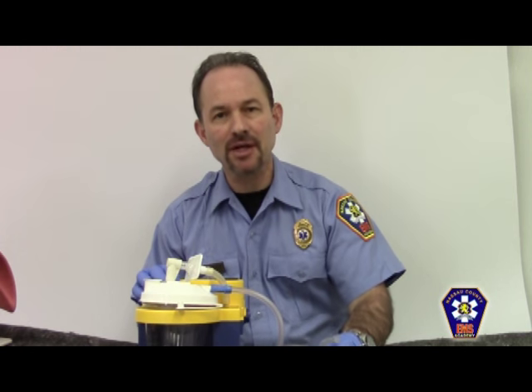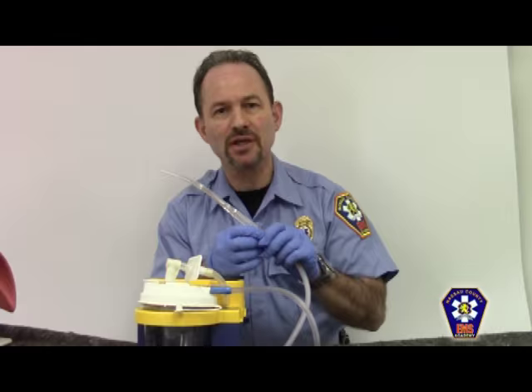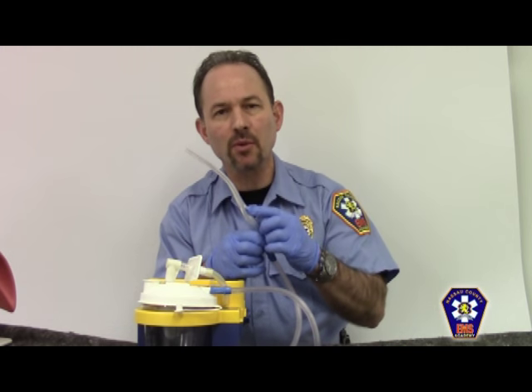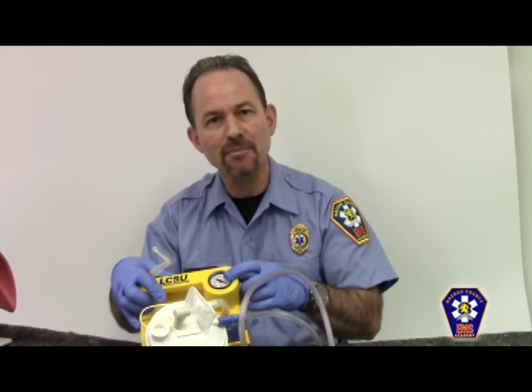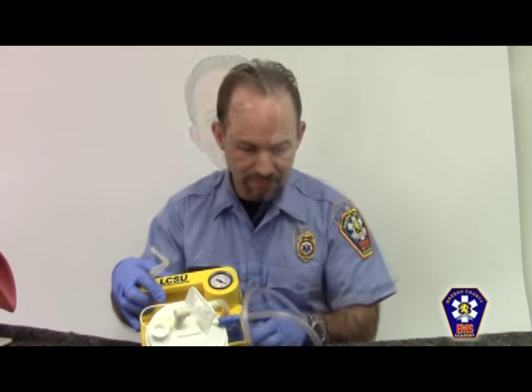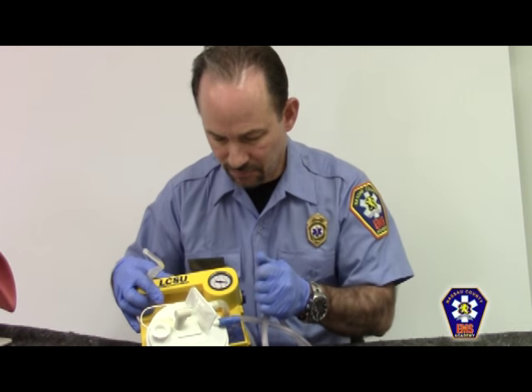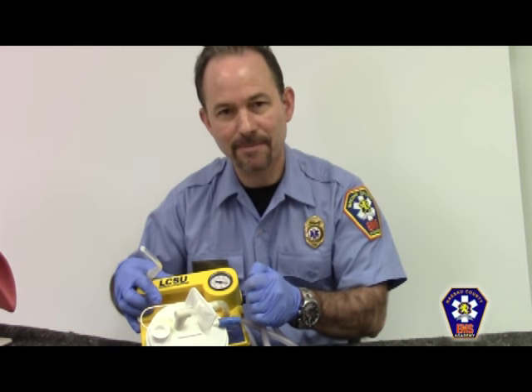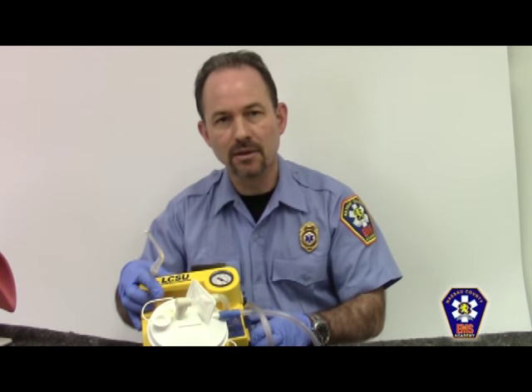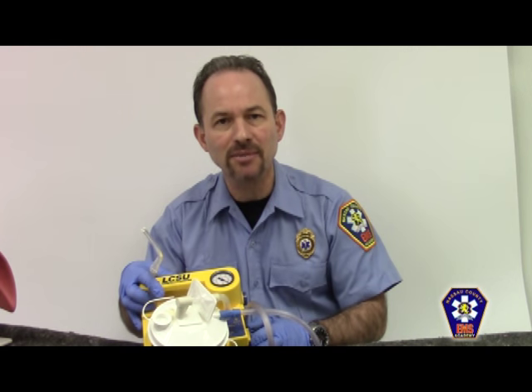When it's time to suction my patient, I must first assemble the equipment. In this case, I have chosen a rigid tip or Yankauer catheter with a whistle-tip control. The next step is to turn on the unit and verify that there is suction by reading the gauge. Once your equipment is put together and tested, it is now time to begin suctioning.